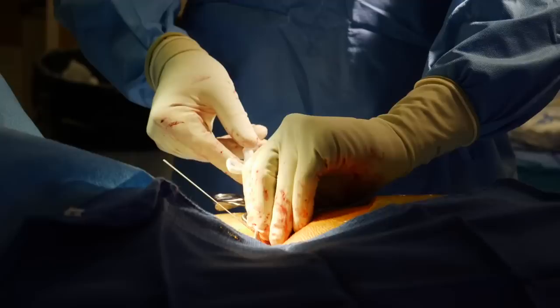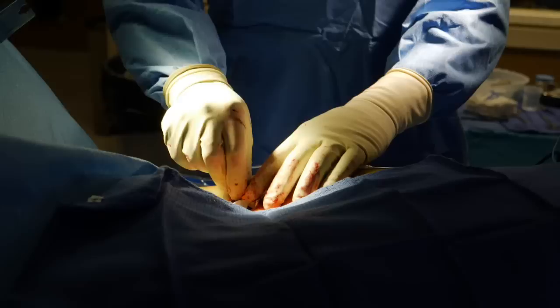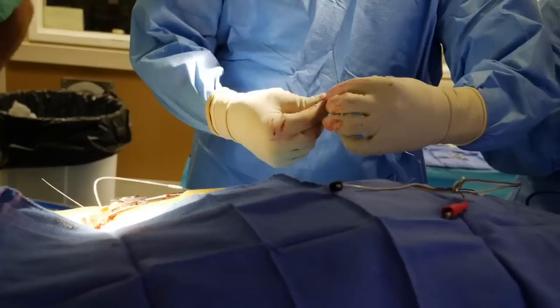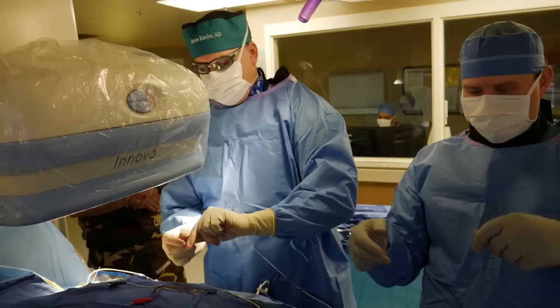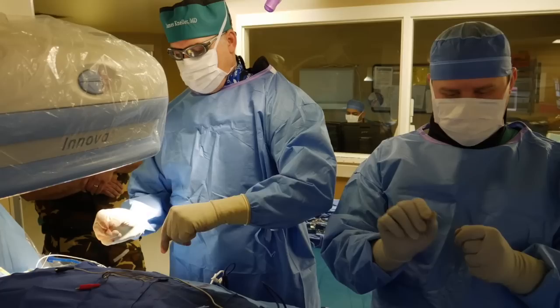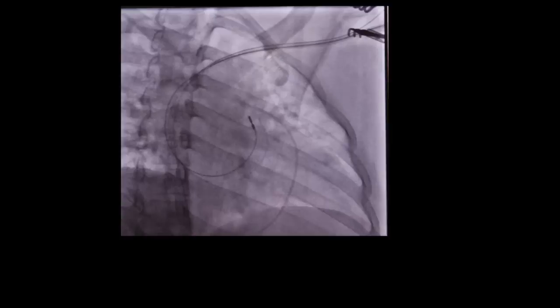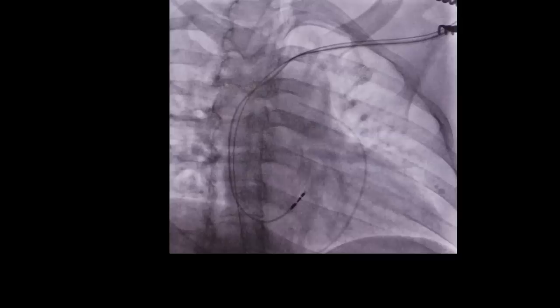There it is on the x-ray image advancing into the vein. Now through that sheath we're advancing the pacing lead — it looks like a wire — down into the heart where we will position it. Here we're shaping the inner stylet that goes through the lead body; this is going to lift the tip of the lead into final position. We're trying to pace the heart from the top of the heart, from the conduction system — we call it the His bundle. We want to engage the normal conduction system directly so that pacing is entirely physiologic. There we're advancing that stylet through the lead, which lifts the lead tip, and we're slowly withdrawing it to engage the conduction system.